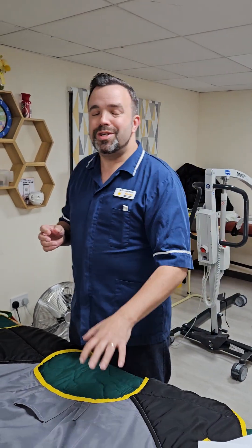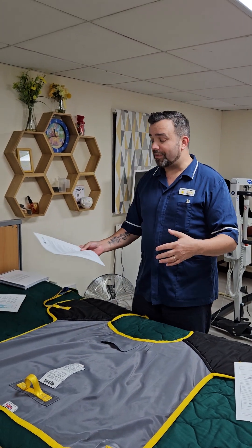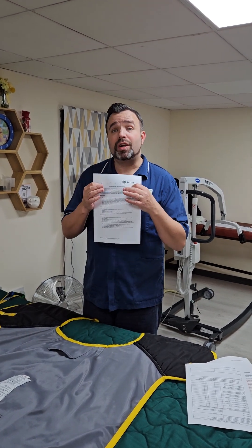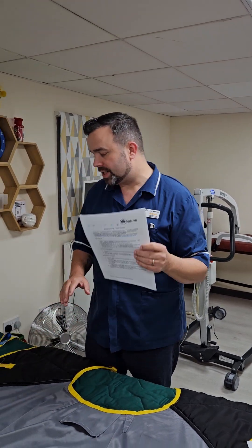If you notice a problem with the sling, it's down to the local authority or the family member to replace it. In Sutton or in most local authorities they'll have their equipment stores. It's important you notify duty, and then the equipment stores can be contacted using the phone numbers or email on these sheets to report that something is wrong with the sling. Do not use the sling if you think it is dangerous.